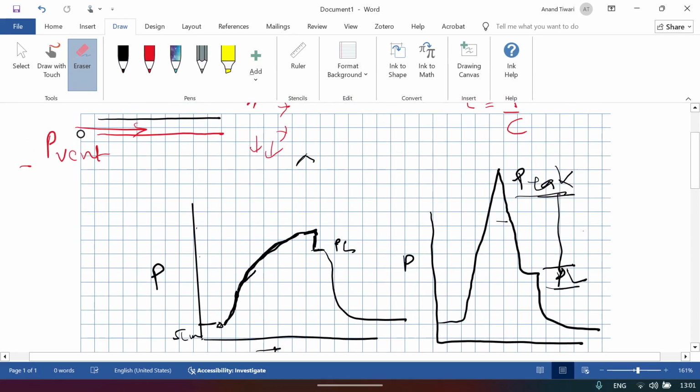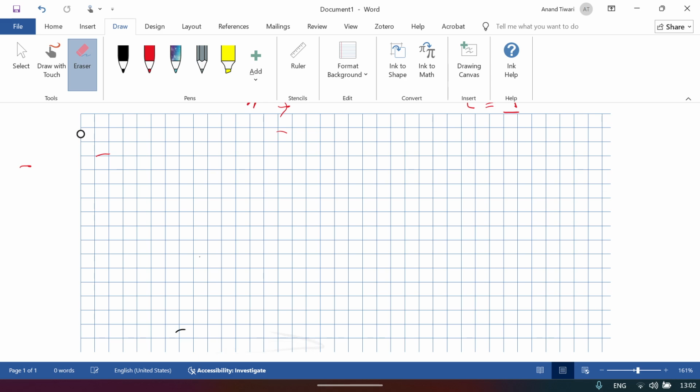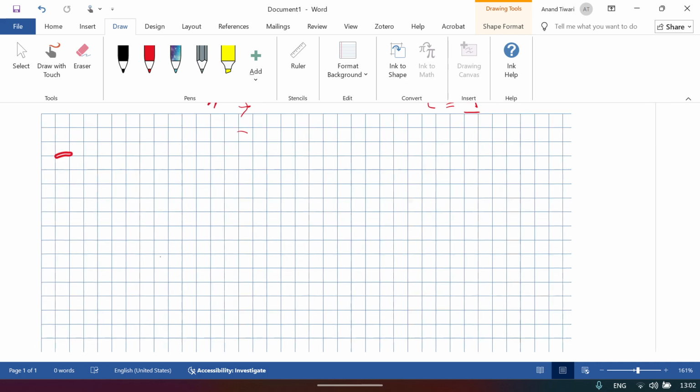Another thing: from the pressure time curve, the pressure time scalar, we can find out the resistance problem, the compliance problem, and we can know about the stress index, over distension, and tidal recruitment.